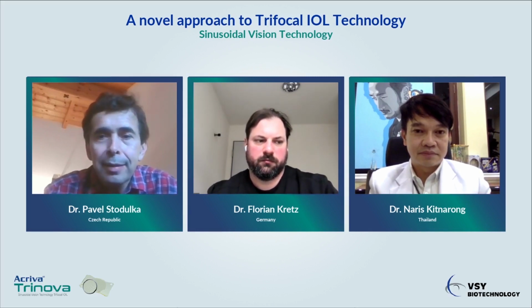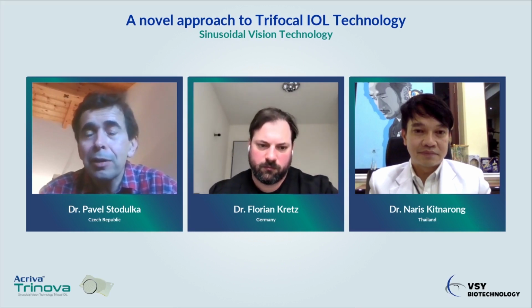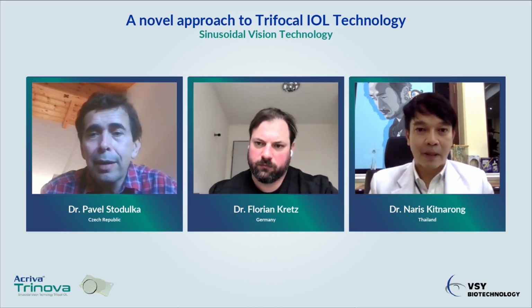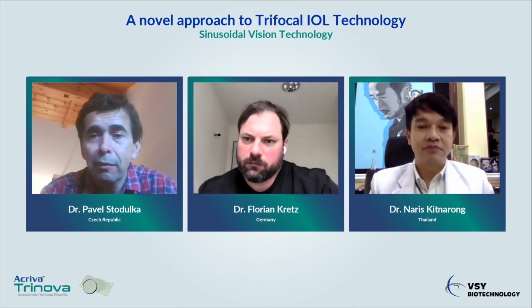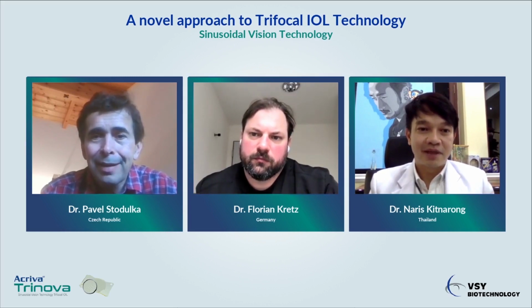So this is someone who says that this technology he places somewhere in between diffractive trifocal with sharp edges and EDOF. But I think in our hands, usually sinusoidal technology really provides reading ability, so that's significantly more than EDOF, correct? Yeah. Okay. I do agree. I think we are clear on that.